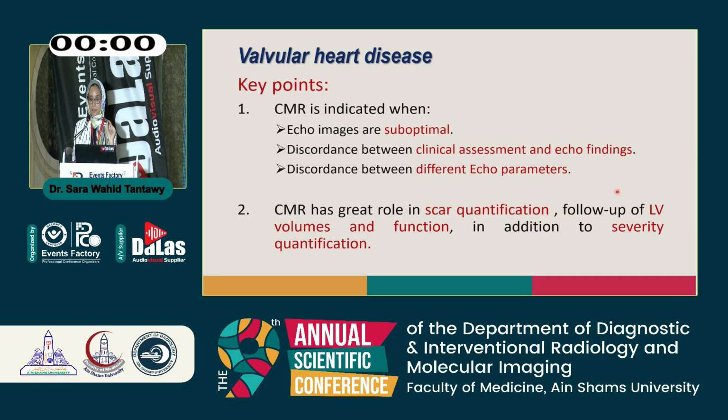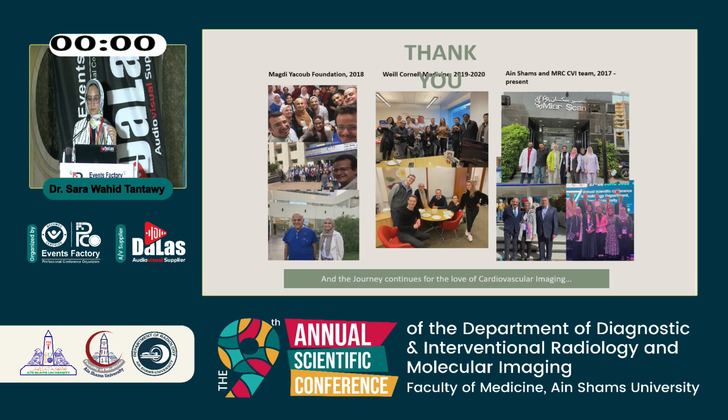And then just to sum up, the CMR is indicated when echoes are suboptimal, or there is discordance between the clinical assessment and echo findings, or discordance between different echo parameters that were done to the patient. And CMR has a great role in scar quantification, LV volumes and function, and to assess the severity of the valvular lesions. Thank you very much.